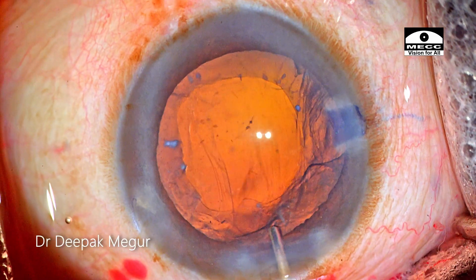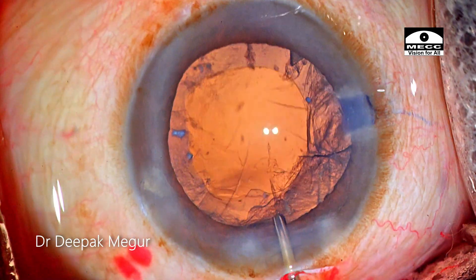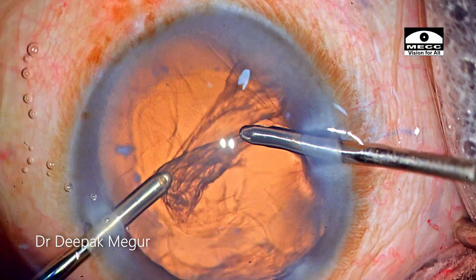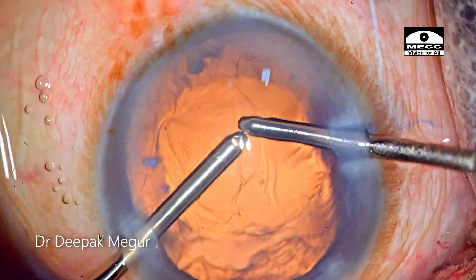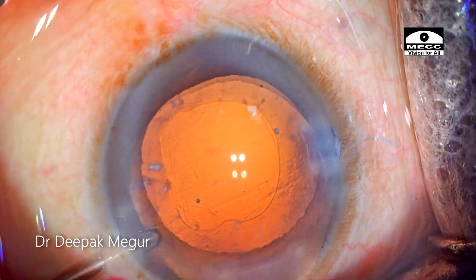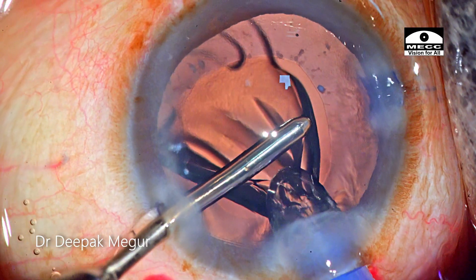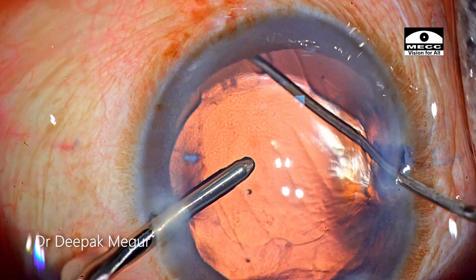Time to remove the cortex. It's customary for me to blow the posterior capsule to loosen up fibers that could be sticking before I start aspirating the cortex. I can see a tiny fragment hiding near the side port — it is expressed out. Cortex aspiration is performed by bimanual irrigation-aspiration cannula. The intraocular lens is then introduced using the irrigation-only method — hydro-implantation. The irrigating handpiece is held above the IOL as it gently unfolds into the bag, and the trailing haptic is dialed in. The case is done.